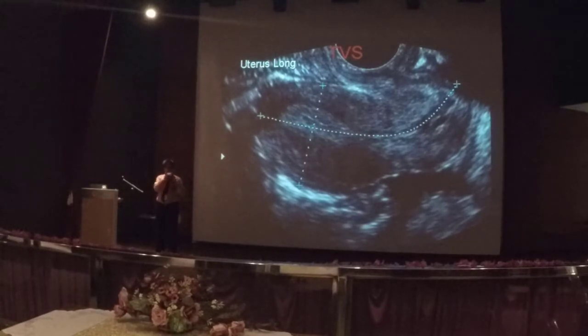Nowadays most of the probes are multi-frequency, so you can change. Sama juga abdominal probe pun sekarang ni kebanyakannya multi-frequency, at least 2 frekuensi. Kalau kat bilik saya 51 tu 3.75 dengan 2.75. So applying that basic principle, if you have an obese patient and you do abdominal scan, you kena pakai higher frequency ke lower frequency? Lower frequency. Then barulah sound wave dia travel lagi jauh. So kalau TVS, because of higher frequency, image expected to be clearer.